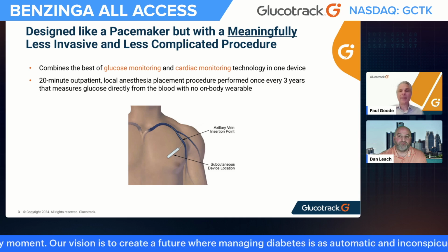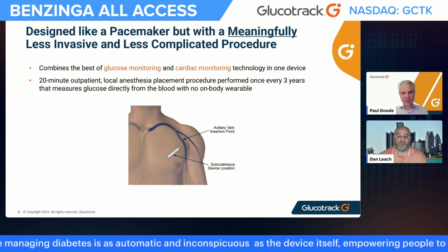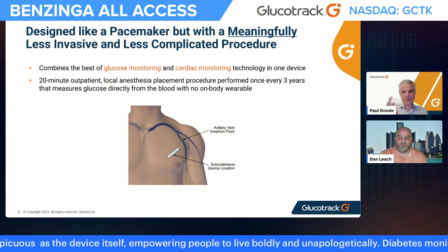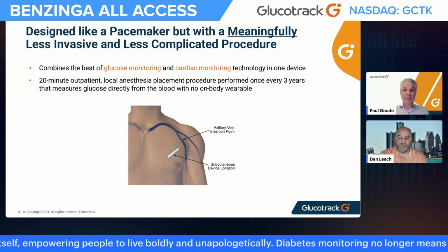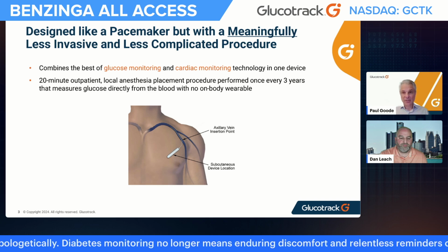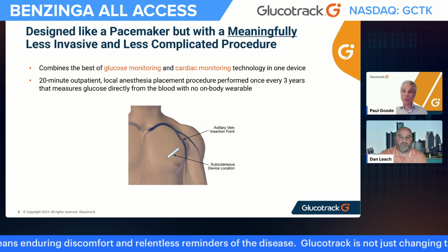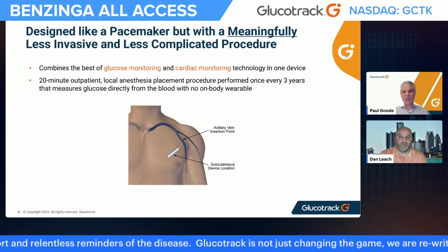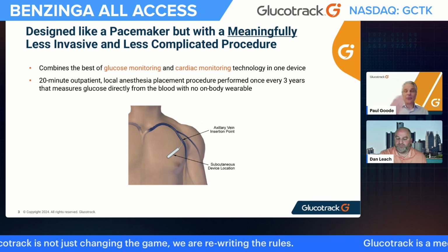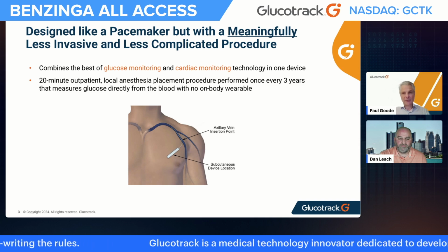Yeah. So we're excited. We just finished that first human study. Now, when you think about our technology, effectively, we've got to prove 5 things, right? We've got to prove that the device is safe to place in the patient, that it's safe while it's in the patient, and that it functions while it's in the patient. Fourthly, that it lasts for as long as, we're talking 3 years here. And fifthly, that it's safe to remove or replace. And so what we did was a small acute study where we could address 4 of those 5 things. The fifth one, of course, is the longevity. That'll be proven in a subsequent study.